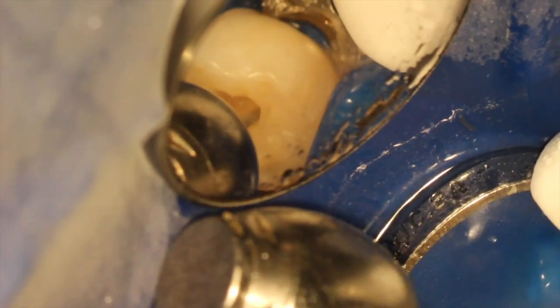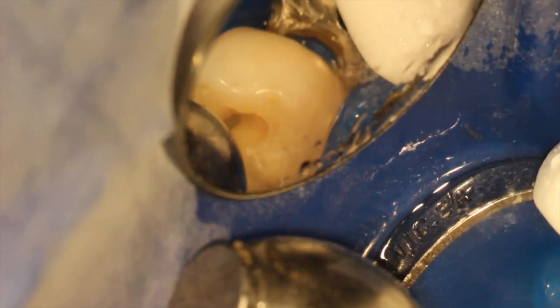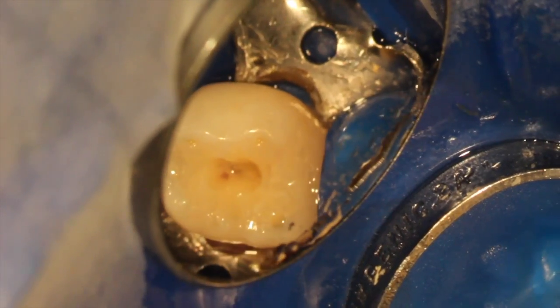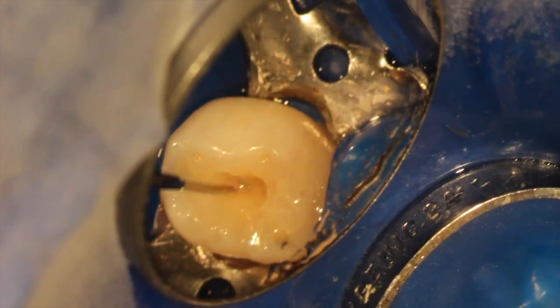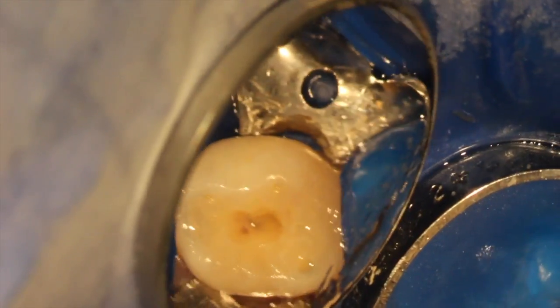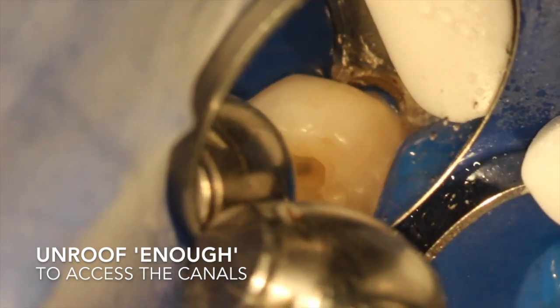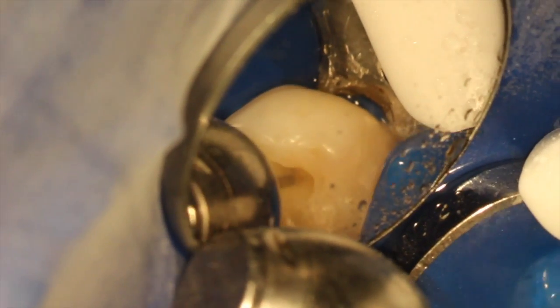As we continue to prep, you'll notice the pulp chamber is shorter. There were pulp stones in this tooth, so I had to be very careful not to perforate — that's the key to treating these teeth, knowing the differences. Everything's a little smaller, and the explorer showed that little pink dot, in this case on the mesio-lingual.